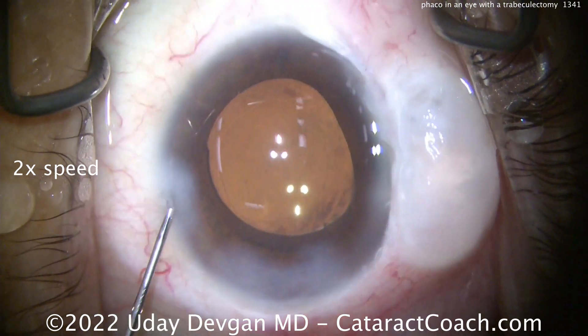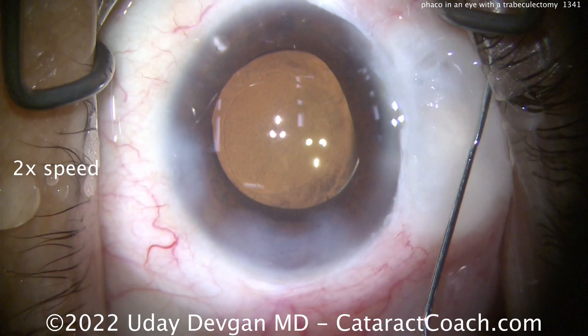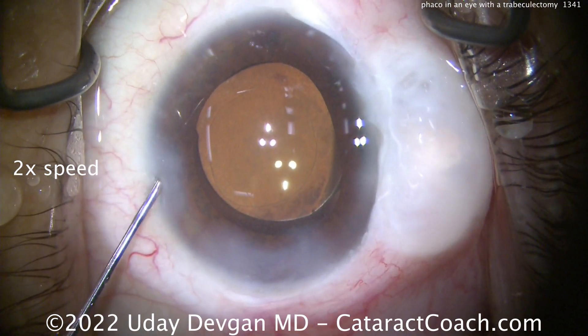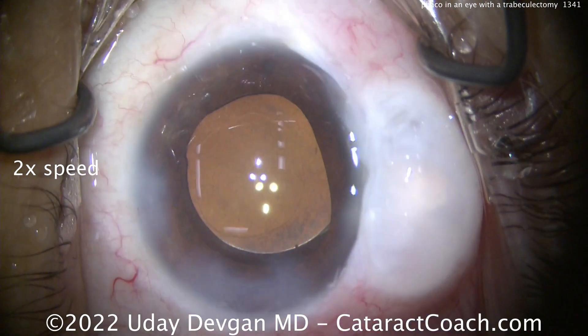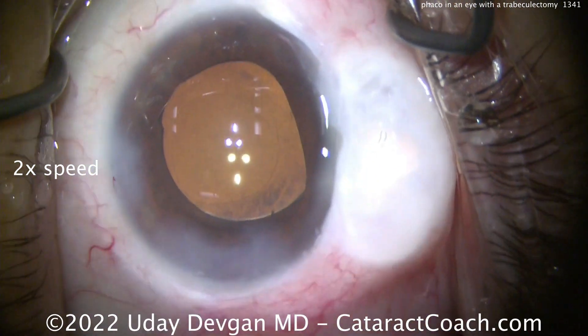Here at the end of the case, we're getting a reasonable IOP — we don't want too much pressure, and we want to be very gentle on that bleb. So let's drop the pressure a little bit. I'm going to check the incision with tetracaine on a Weck-Cel sponge to make sure the incisions are sealed.